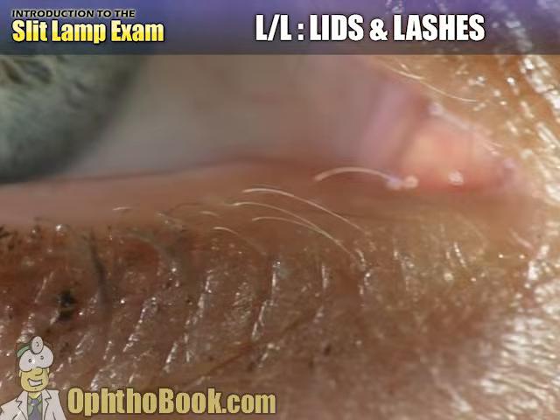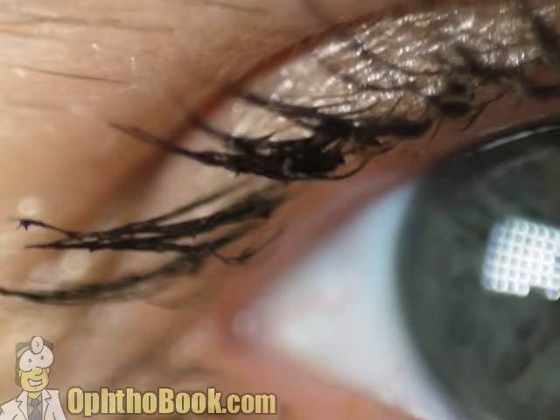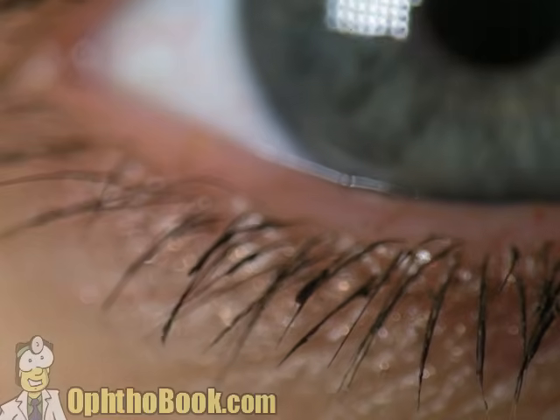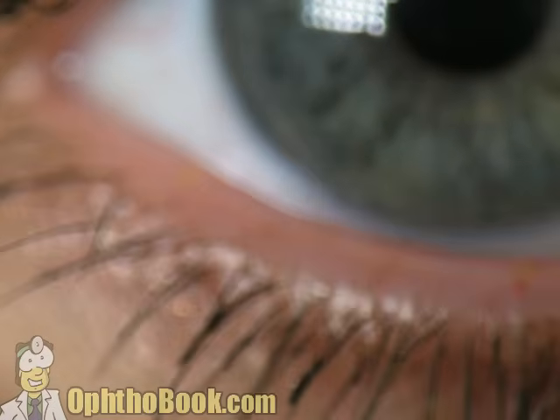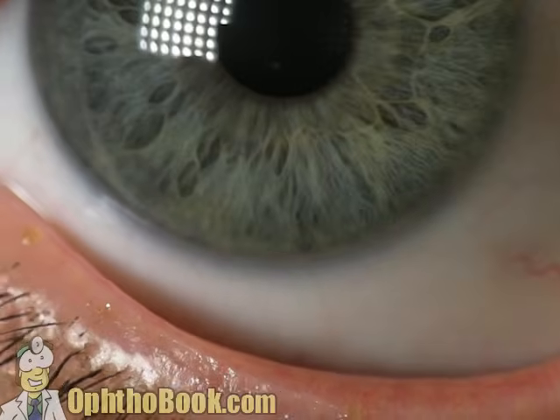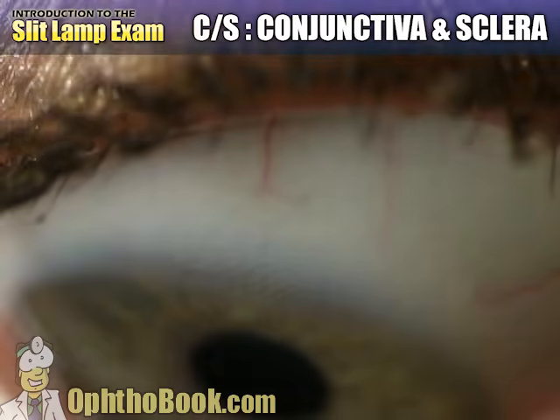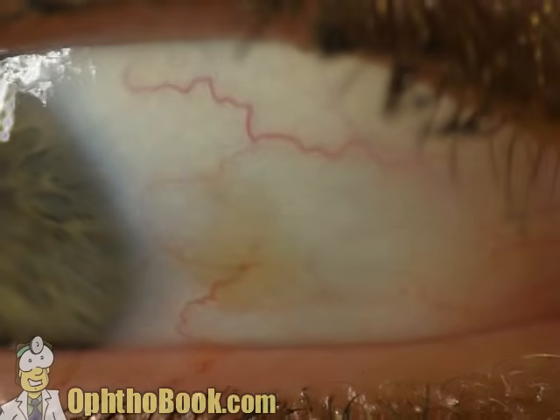Look at our lids and lashes, we look at our lid margins, and we look at our lash line within normal limits here. Some makeup in the corner, but that looks fine. I always flip the lower eyelid down, make sure there's no lesions there, and if they have symptoms, I'll often flip the upper, but always the lower since it's so darn easy to see. The conjunctiva and sclera, the surface conjunctival vessels, and the sclera, I have my patient look up, down, left, and right, so we don't miss anything.